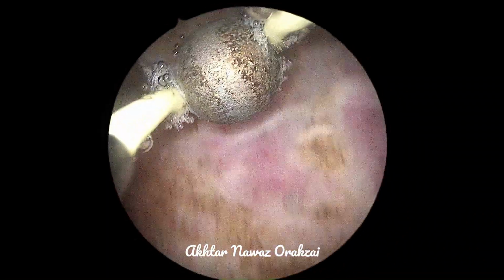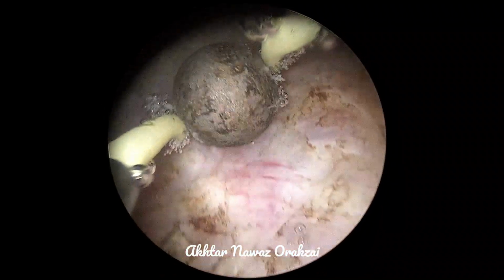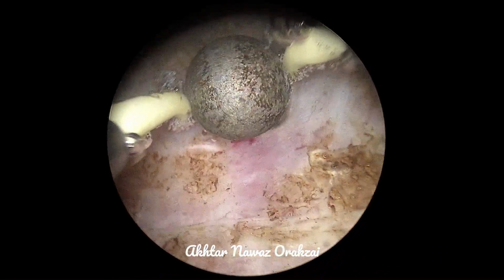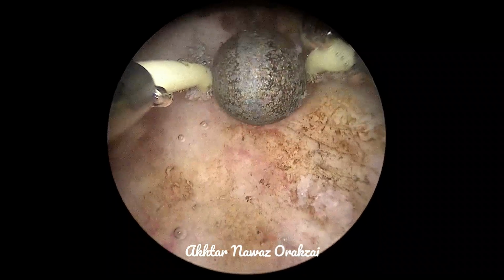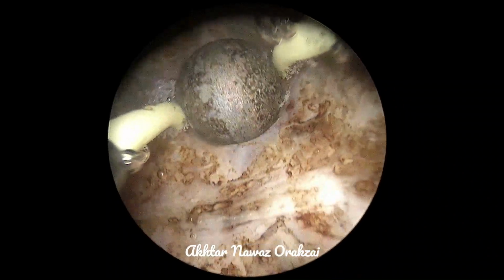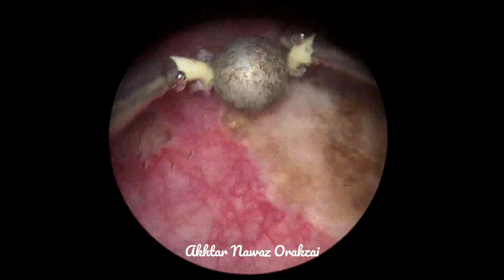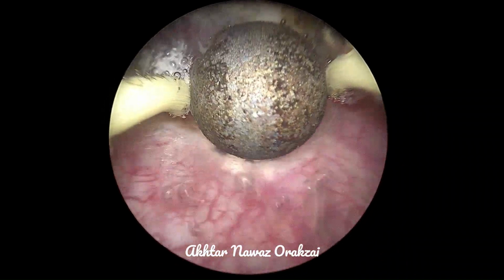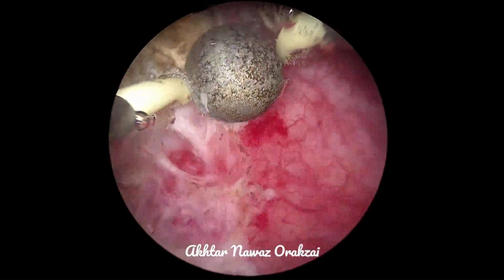Coagulating around the mucosal edges gives two advantages. Number one, it coagulates the small multiple submucosal vessels early, and secondly, it also fulgurates the mucosa around the mass or the malignant tissue. Always fulgurate the areas which seem to be suspicious for malignancy.